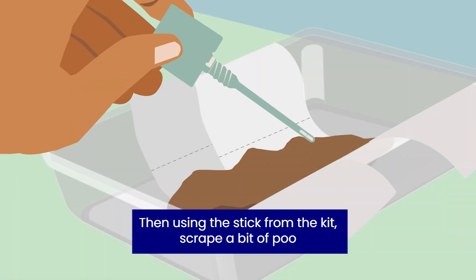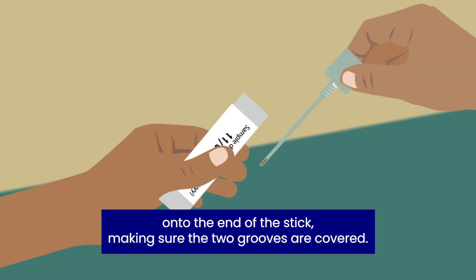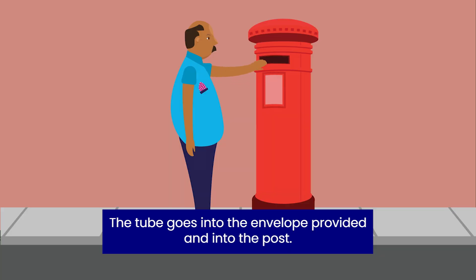Then, using the stick from the kit, scrape a bit of poo onto the end of the stick, making sure the two grooves are covered. Put the stick back into the tube and twist it to close. The tube goes into the envelope provided and into the post.